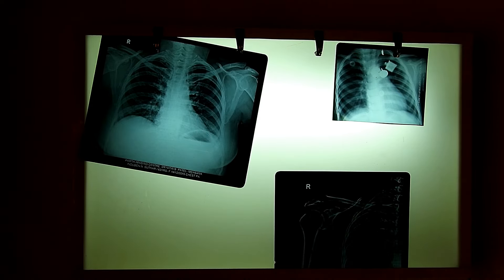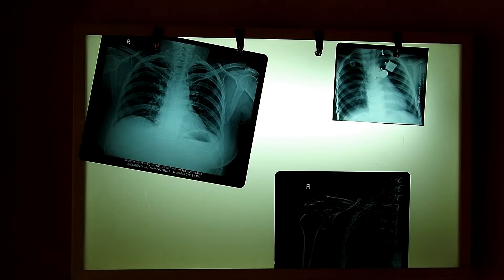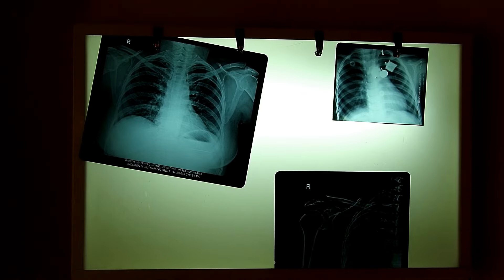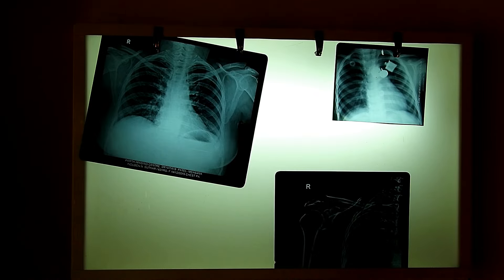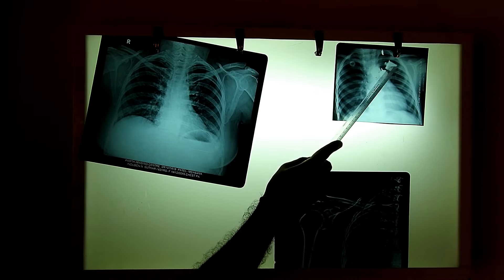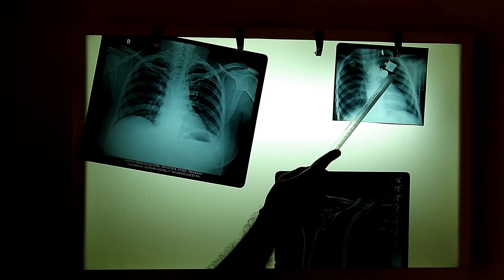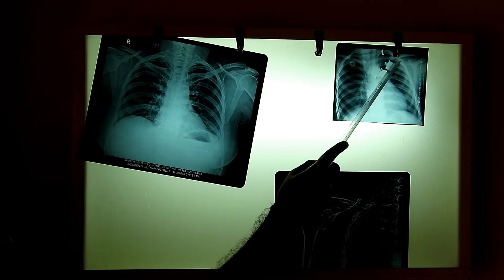Lastly, if the patient is wearing any metal structure, it will appear as a brilliant white color, even whiter than the shadow of the bone. For example, in this X-ray, a locket appears as a brilliant white point.